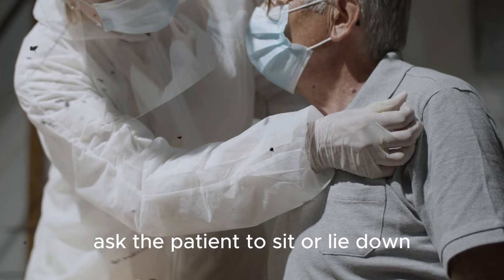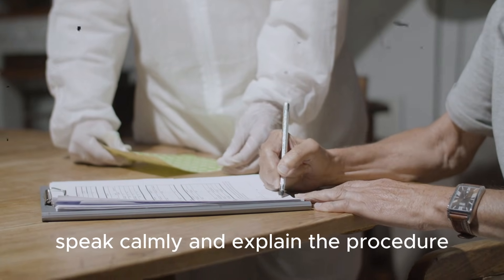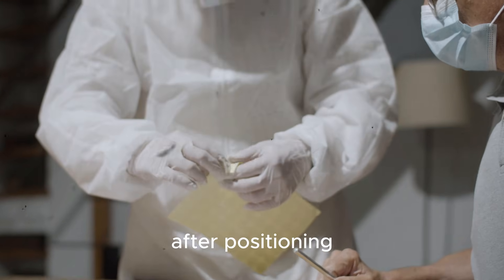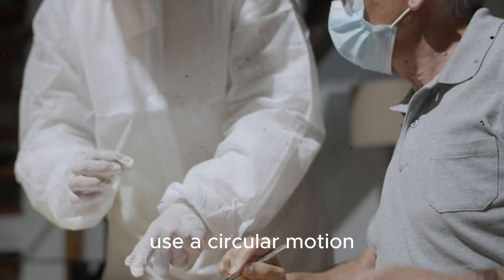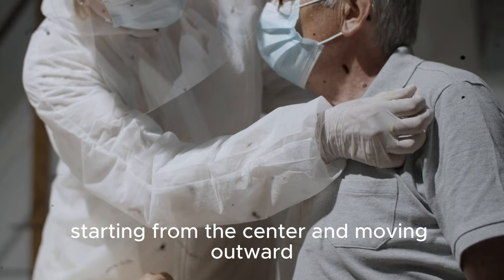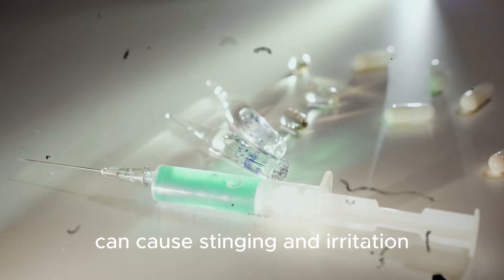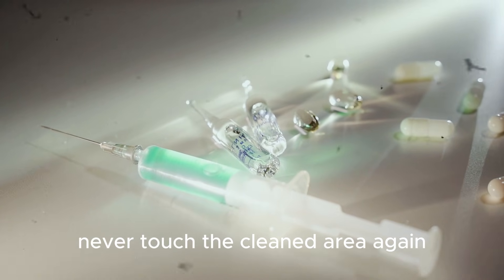Ask the patient to sit or lie down depending on the injection site. Speak calmly and explain the procedure — this helps reduce fear and builds trust. After positioning, clean the injection site with an alcohol swab using a circular motion, starting from the center and moving outward. Allow the skin to dry completely, as injecting through wet alcohol can cause stinging and irritation. Never touch the cleaned area again.